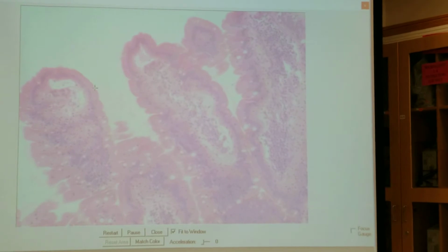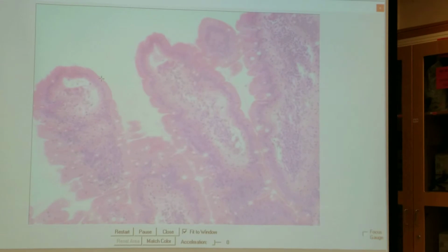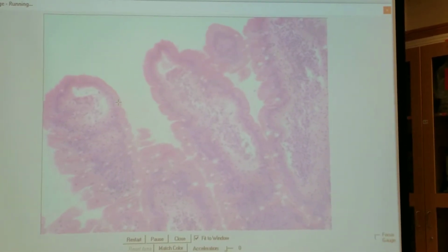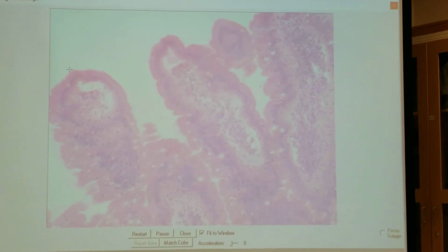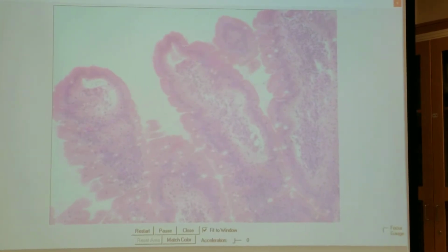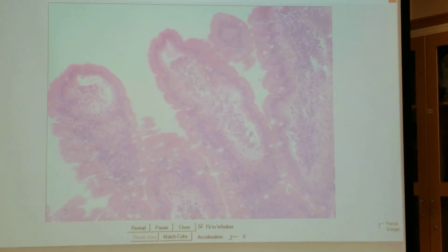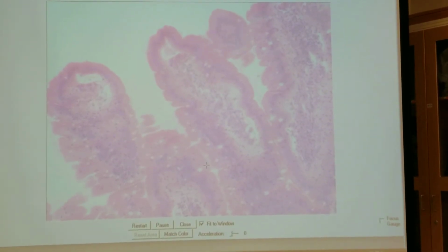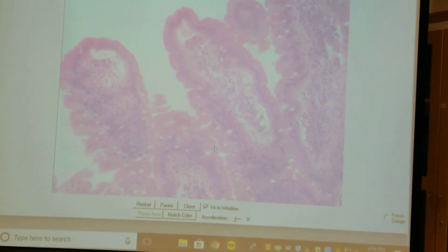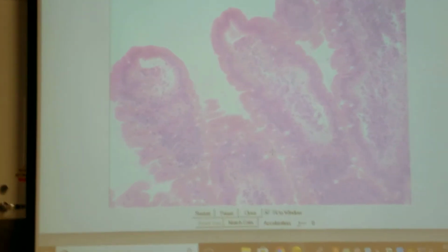Here we can actually see the tips of the cells, especially on this side, because they look fuzzy. That's because each cell has this top membrane folded back and forth a bunch of times to make microvilli. Then we take a line of cells and fold them up like this to make this big bump called a villus. We'll make multiple of those called villi. At that point, it's going to look like shag carpeting. Then we take that entire shag carpeting and push the two edges towards each other. That big fold is going to be a plica. So the plica will have villi sticking off of it, and if we zoom really close into the villi, we'll see that the villi have microvilli. So we've got three different levels of surface area in our small intestine.